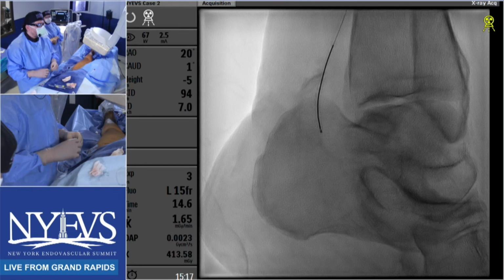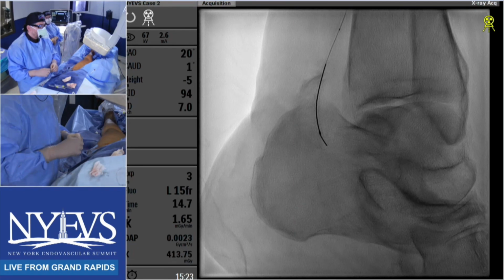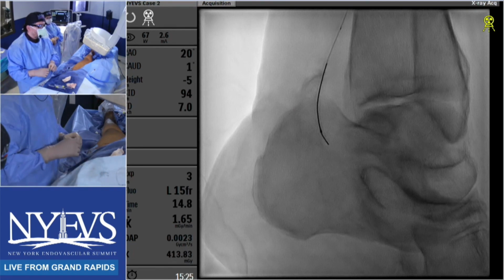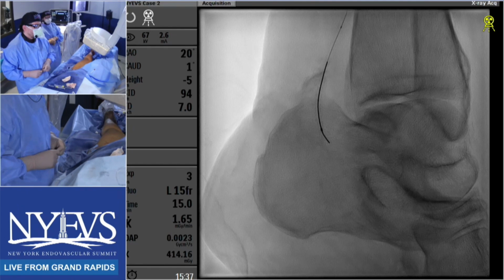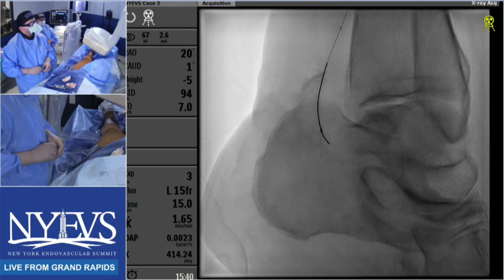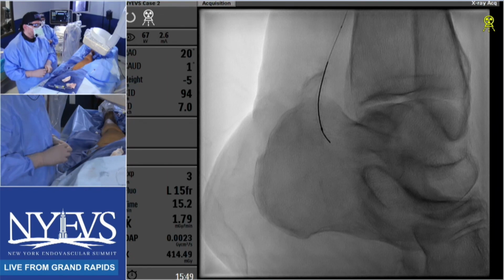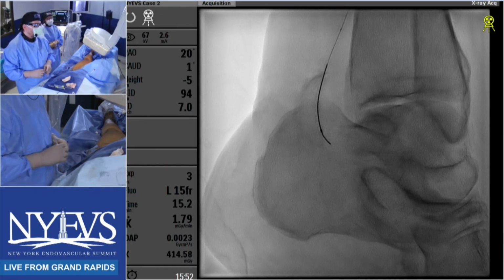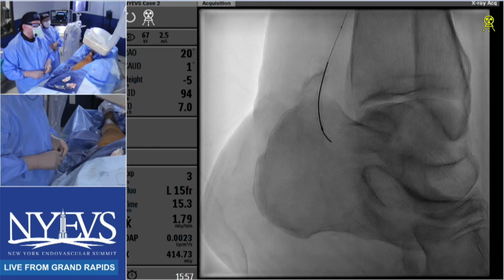I don't like to say these things are by feel, but honestly, this one here in this area is by feel. So I'm gently trying to poke with my wire in the hopes of penetrating this cap here, and let's see what happens. So what wire do you have right now? This is a 12-gram tip wire. I'm rotating it. You want to multiply the 12 grams by 4, because look at the distance between the tip of my wire and the balloon, right? Yep.